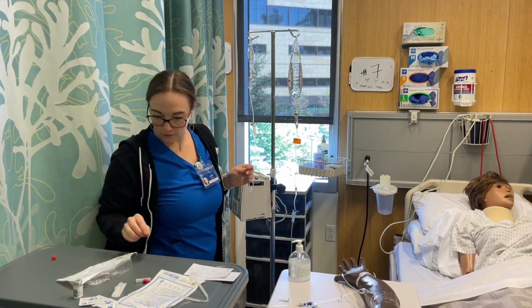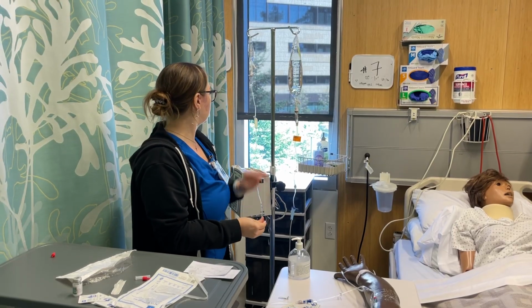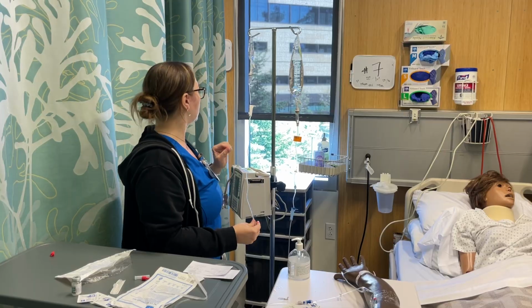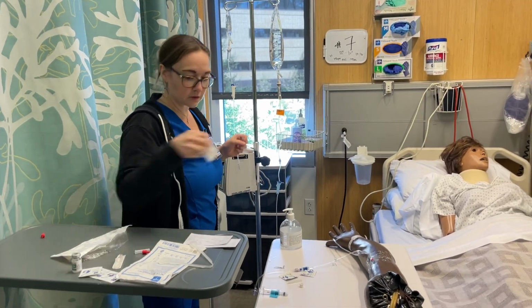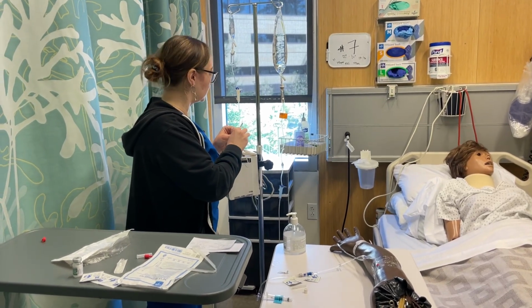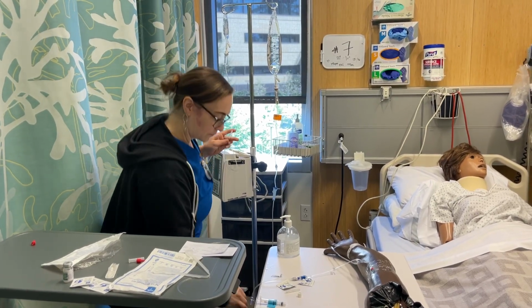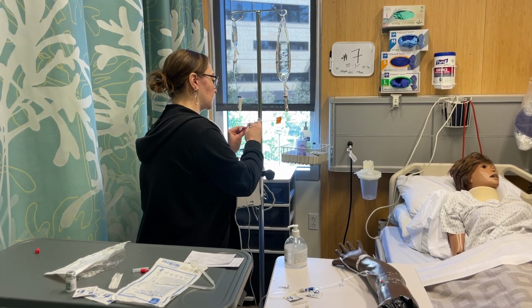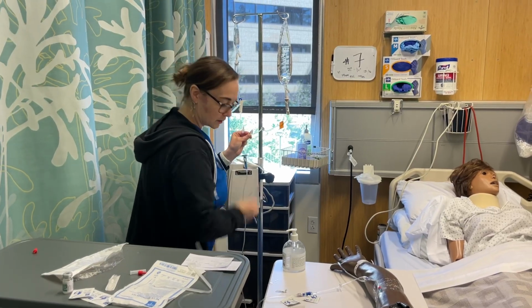And then I would label this, and I'll make sure that this is locked, and this gets changed every 24 hours. Okay, I'd get another alcohol swab. And I would clean off the primary. Clean this off. 30 seconds. So that is dry.